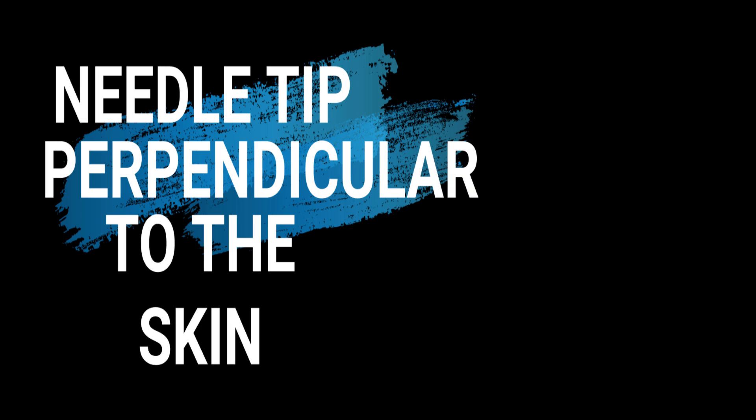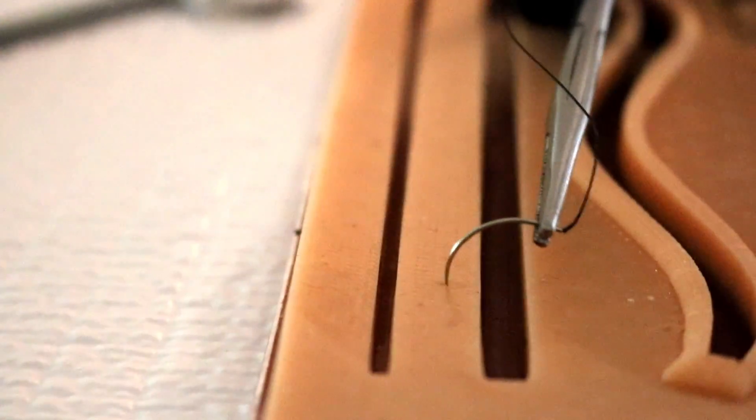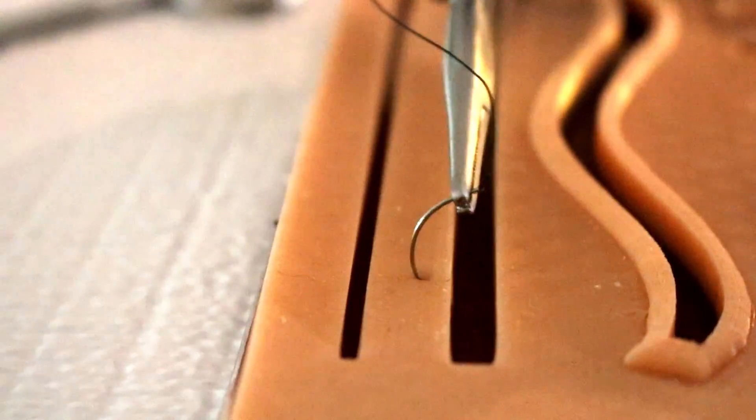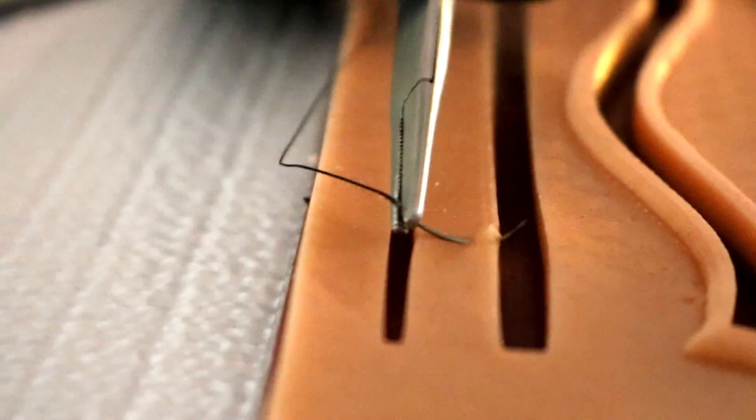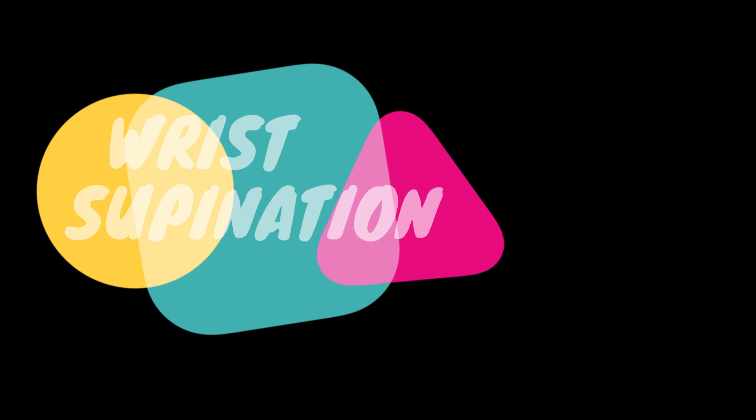Alright needle tip perpendicular to the skin. Very important when you're about to go in you see this picture here. Alright perpendicular the needle tip point perpendicular and then you're gonna supinate your wrist. You see that great supination there and that's how you're gonna take your first bite.